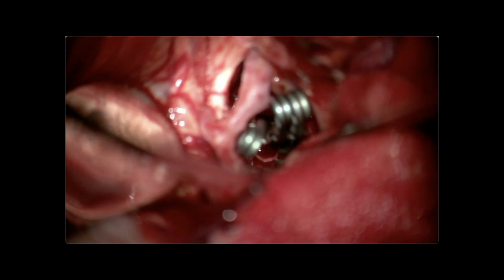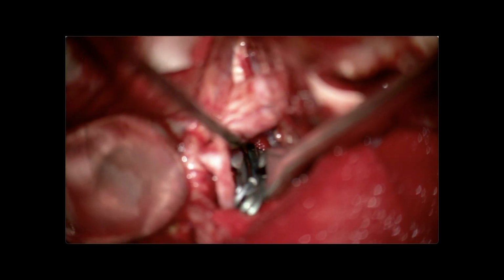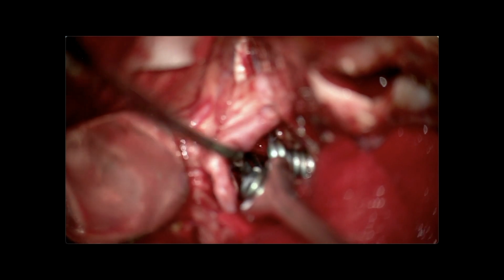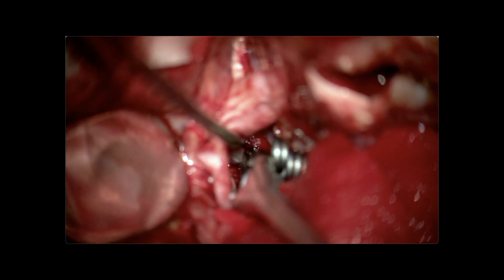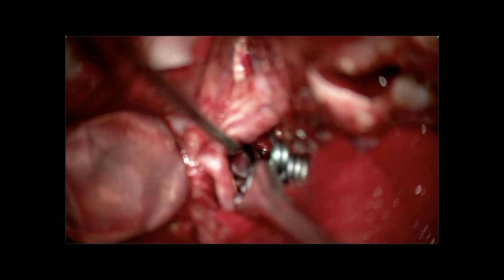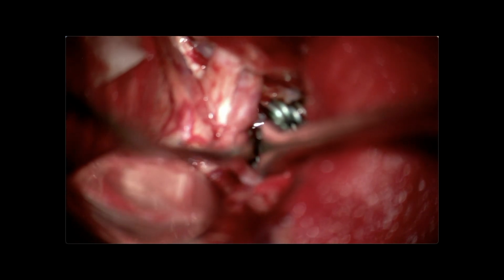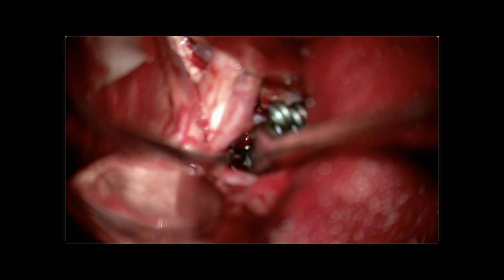The situation requires the application of a clip to completely close the aneurysm sac. When trying to remove the clip from the dome of the aneurysm, it enlarges and bleeding occurs. To completely eliminate the aneurysm, another straight clip is applied.